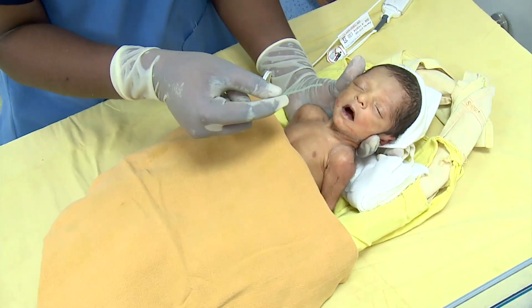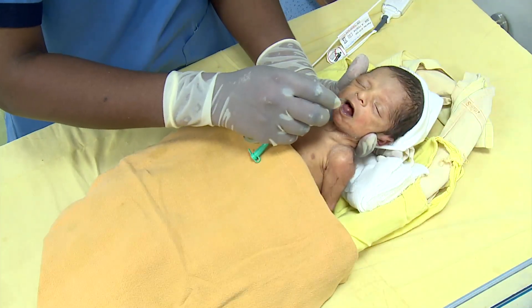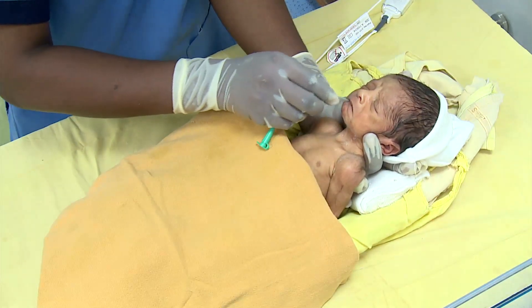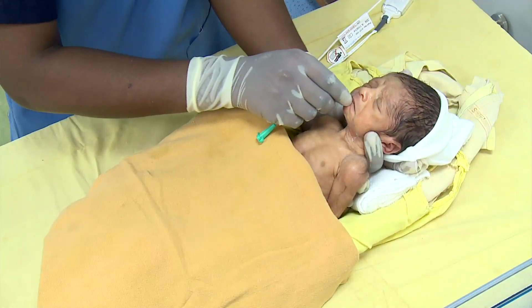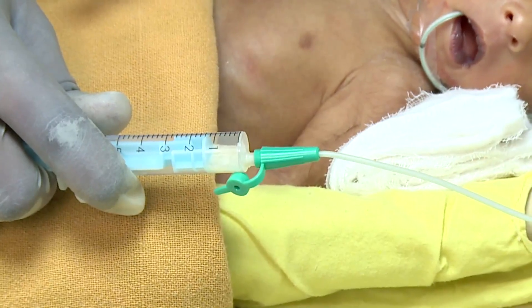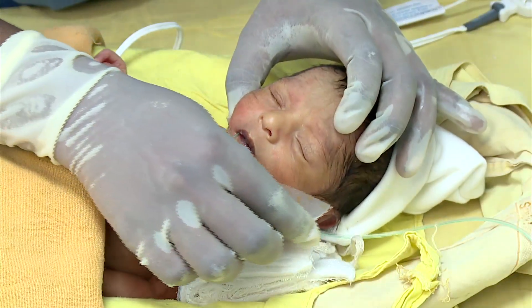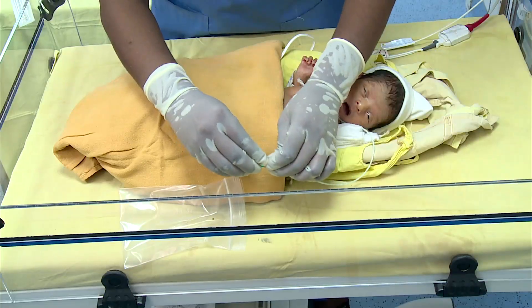Hold the feeding tube one to two inches from the tip. Insert the orogastric tube following the natural bend of the tube. Check the tube placement by drawing the gastric content. Secure the tube using micropore tape or Tegaderm.